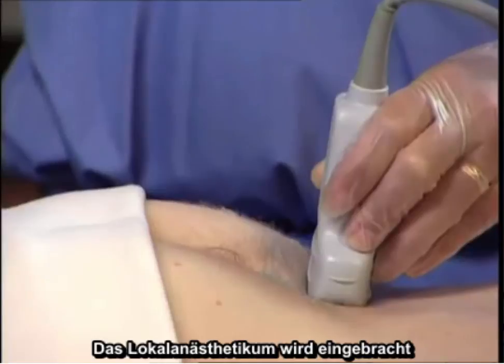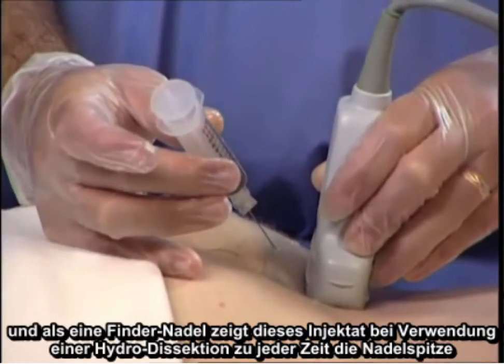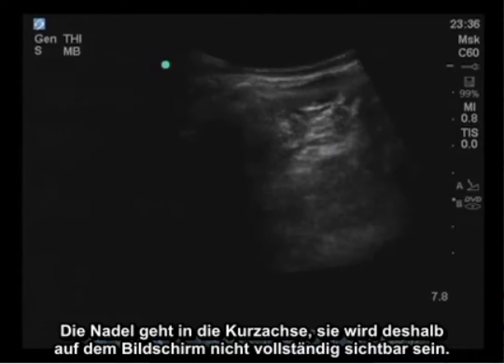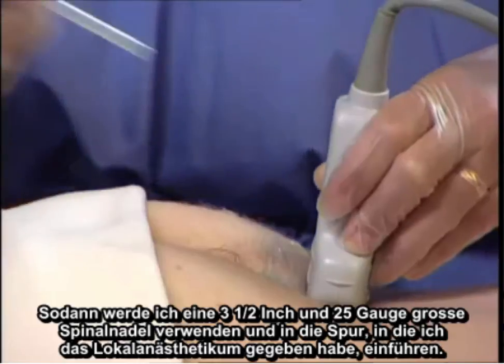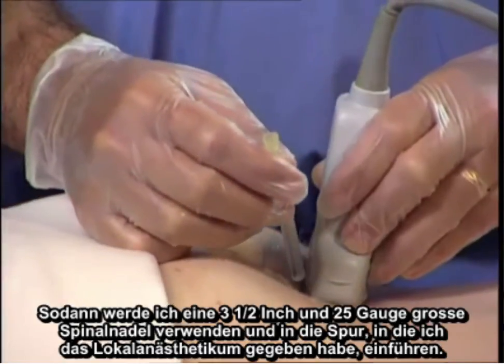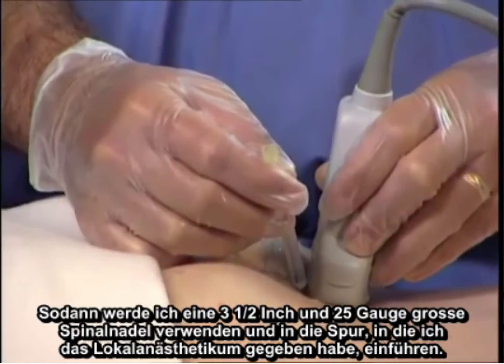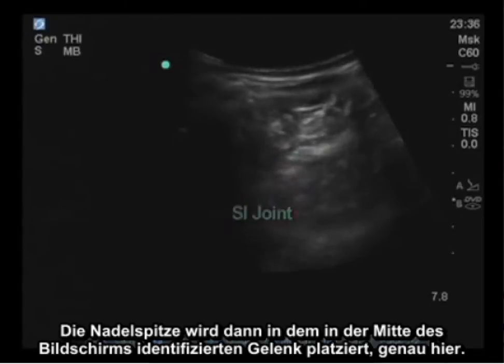Local anesthetic is placed, and as a finder needle, this injectate using hydrodissection demonstrates the needle tip at all times. The needle is going in the short axis, therefore it won't be completely visualized on the screen. However, hydrodissection can help identify where the tip is at all times. Then I'll utilize the three and a half inch, 25 gauge spinal needle and enter that track that I have placed local anesthetic within. The needle tip will then be placed within that joint identified in the center of the screen.